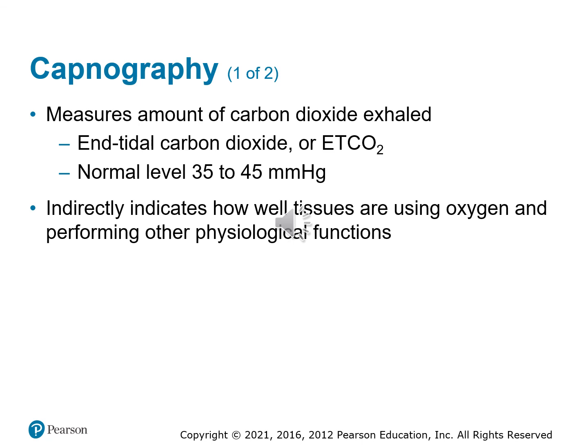I can tell you in cardiac arrest, it's kind of our last tool to know if we have a chance at saving a patient. Usually that capnography number will maintain below normal levels, and then right before you get spontaneous pulse from the patient again, you'll start seeing that capnography increase. It's kind of that first indicator that things are correcting themselves in that situation.